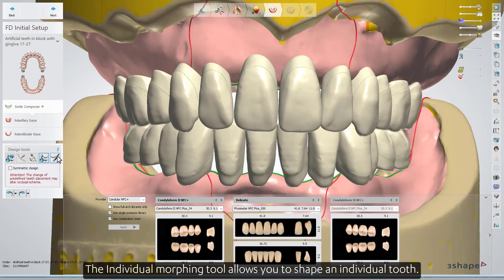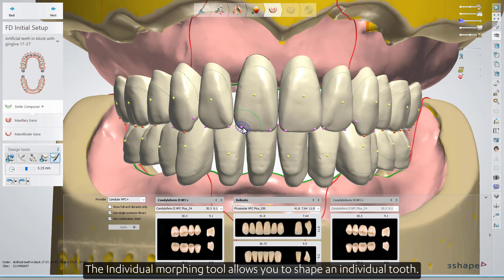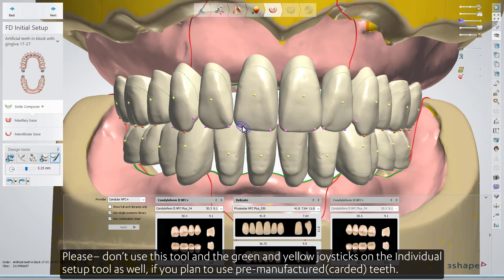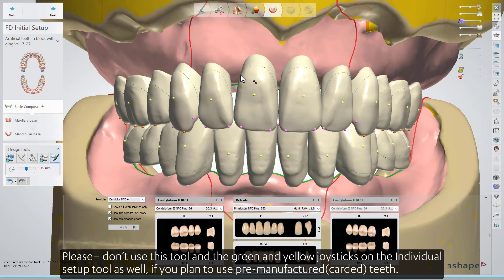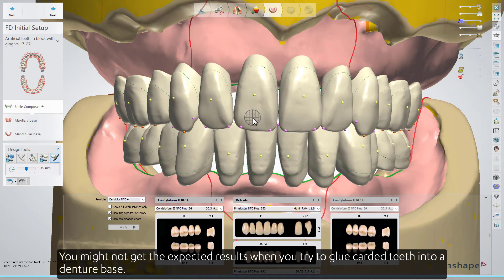The individual morphing tool allows you to shape an individual tooth. Please don't use this tool and the green and yellow joysticks on the individual setup tool together, if you plan to use pre-manufactured carded teeth — you might not get the expected results when you try to glue carded teeth into a denture base.